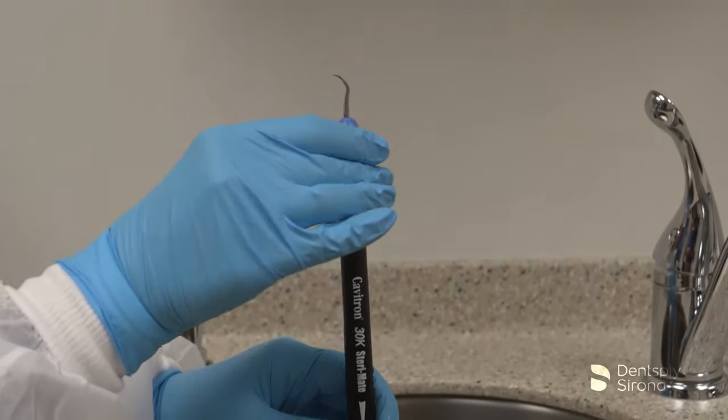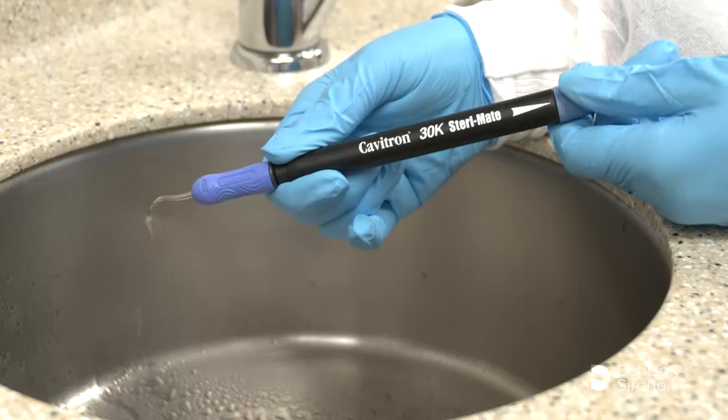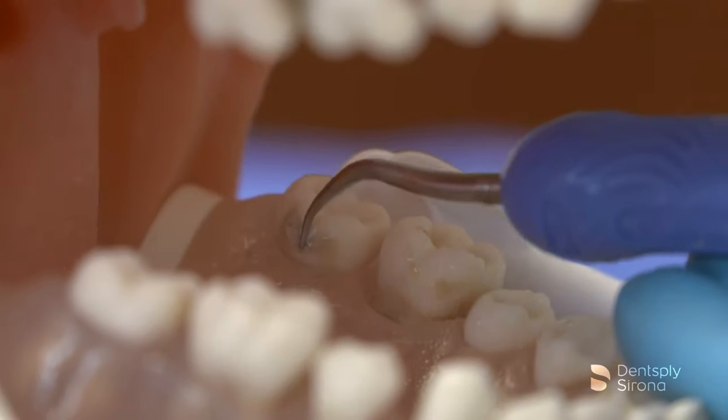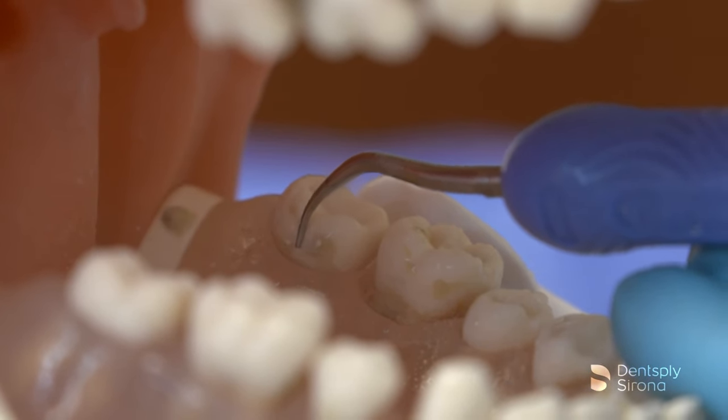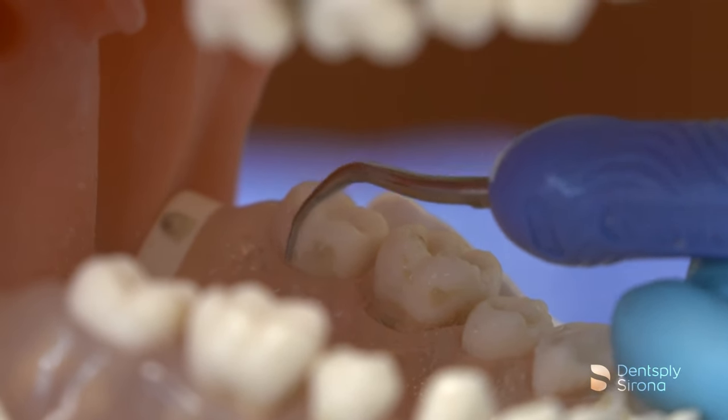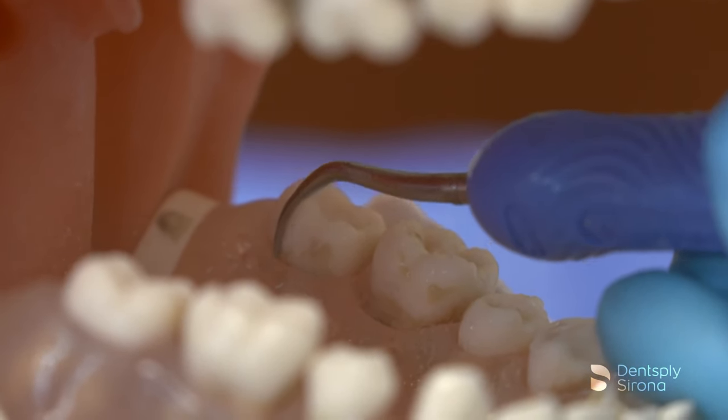After the clinician has seated the insert, selected the power, and adjusted the spray properly, instrumentation begins according to the treatment plan. The clinician utilizes the Cavitron FSI-1000 insert for deposit removal along the line angles and interproximal surfaces where heavier deposits are present.